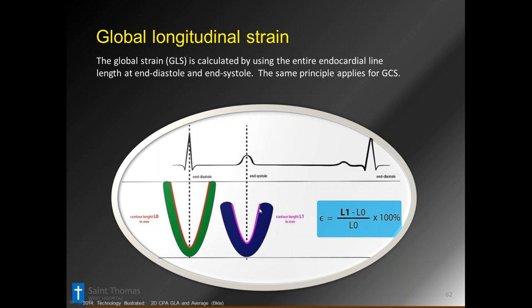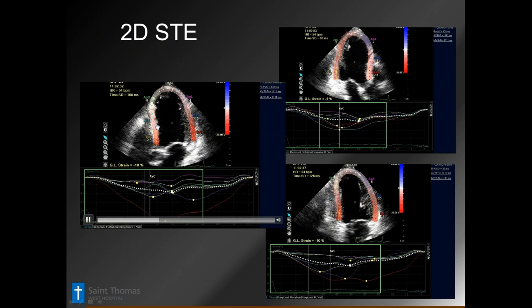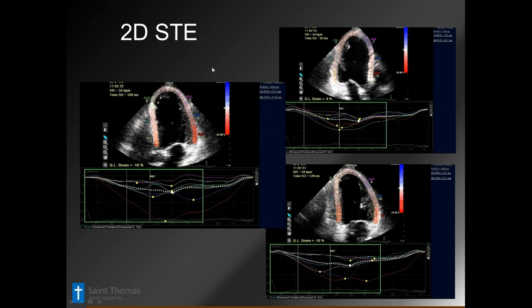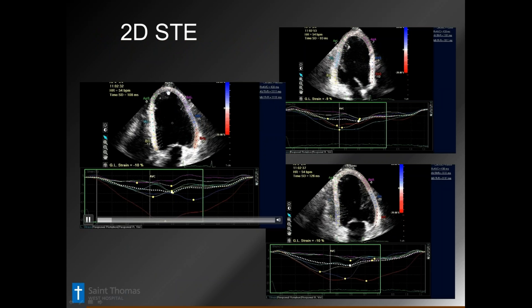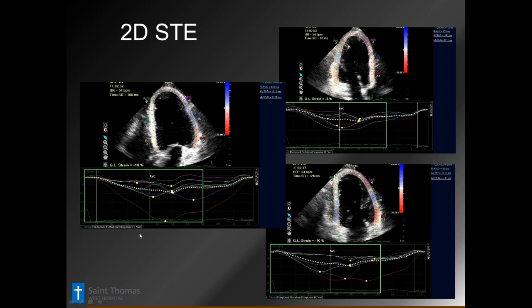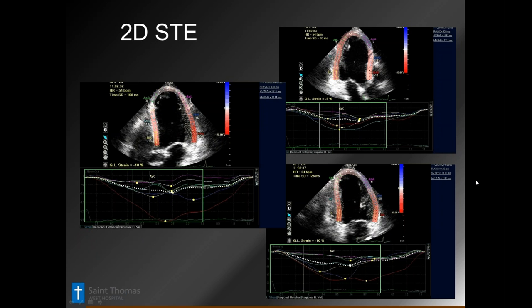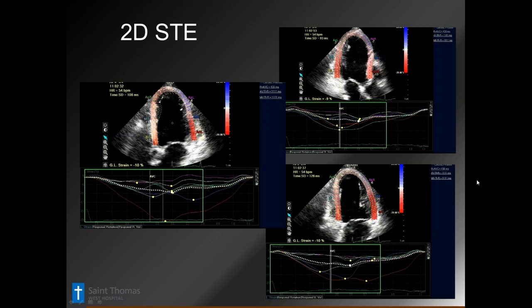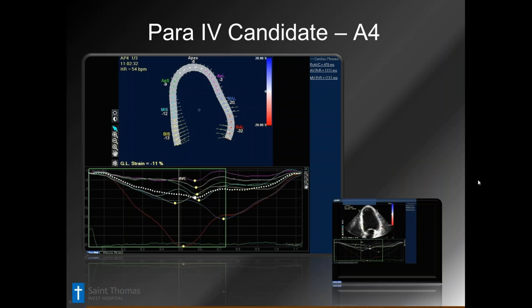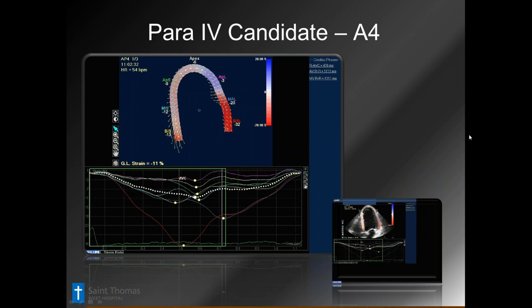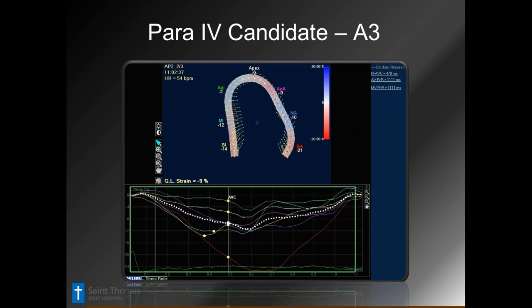Here we look at the longitudinal strain in 2D with vectors turned on. Vectors give you a sense of the timing of the heart and which walls are really moving. You can see there's very little going on. The global longitudinal strain is minus 10 in the 4-chamber, minus 9 in the 3-chamber, and minus 10 — giving a longitudinal strain of about 10. This is isolating those vectors so you can see how the apical region has very little strain. But now we have data underneath that qualitative assessment that we can use, and we're taking all of this into 3D imaging.